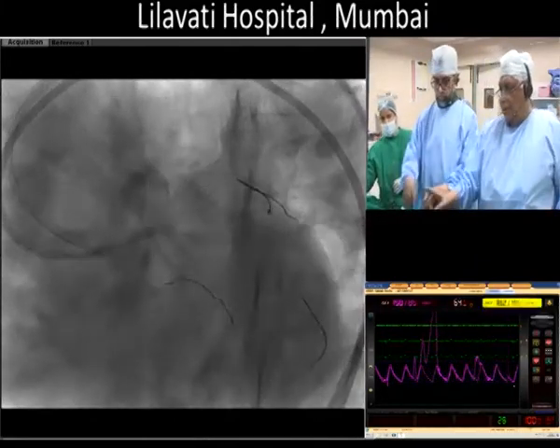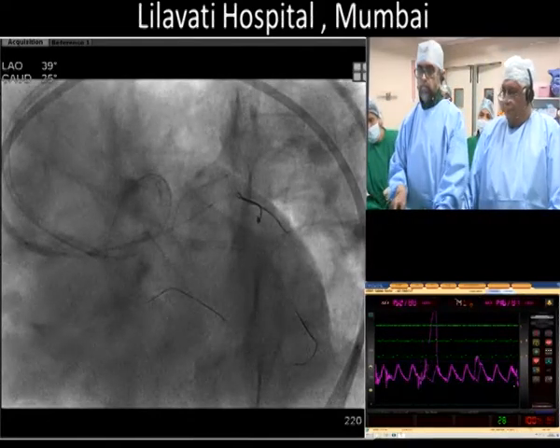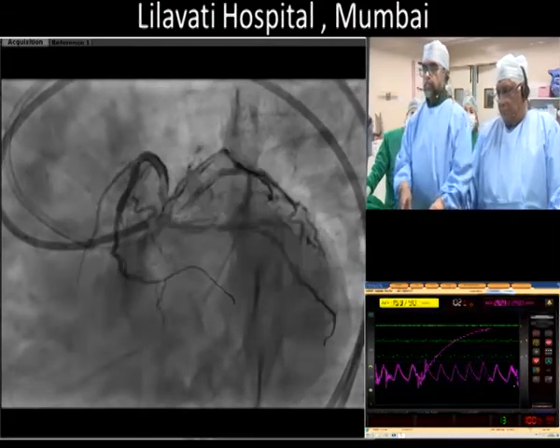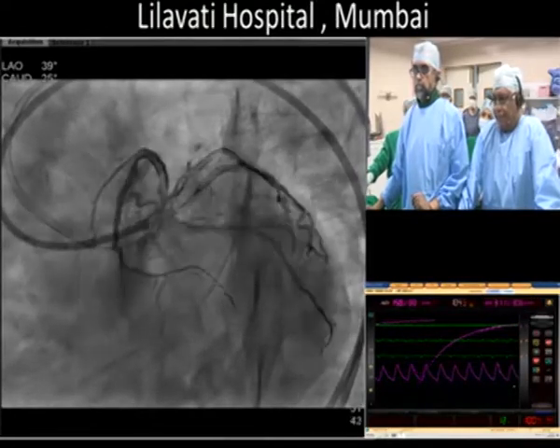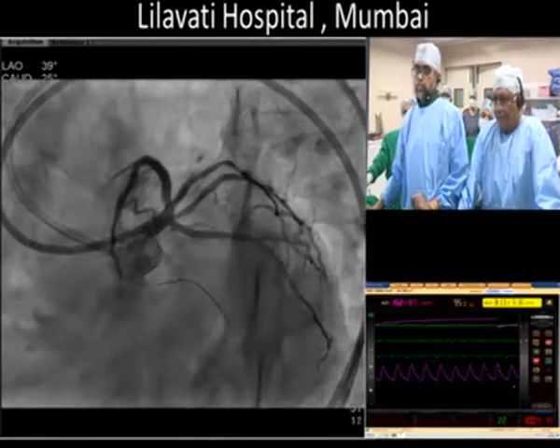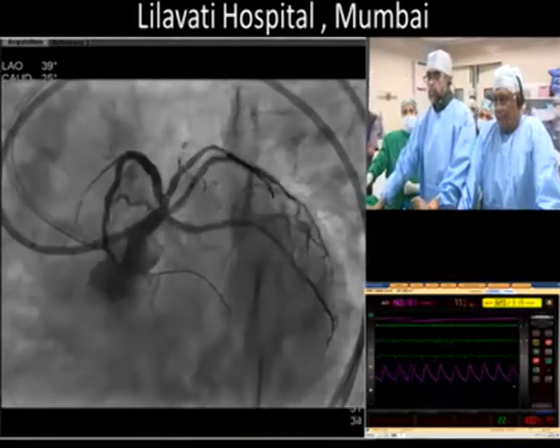I noticed in the proximal LAD stent, do you see something? The overriding diagonal underneath it with the haziness. That's the diagonal, it's not the LAD. And there's also a small dissection in the ramus.